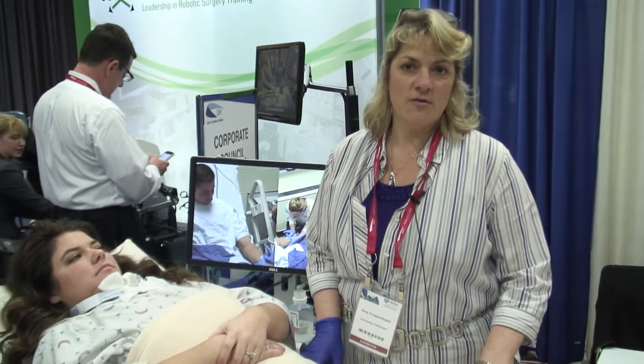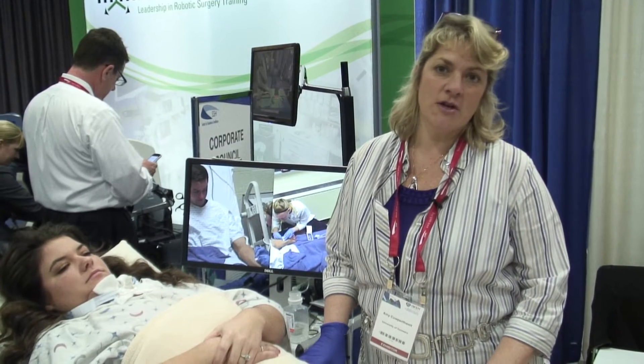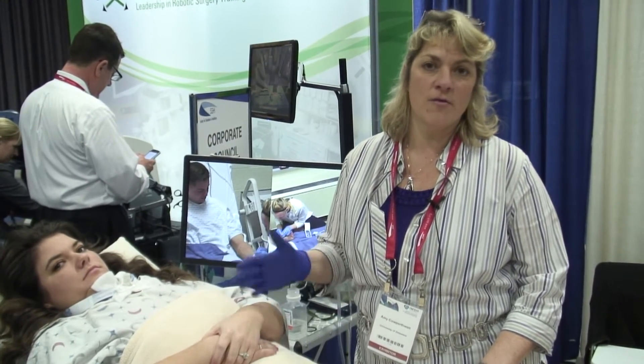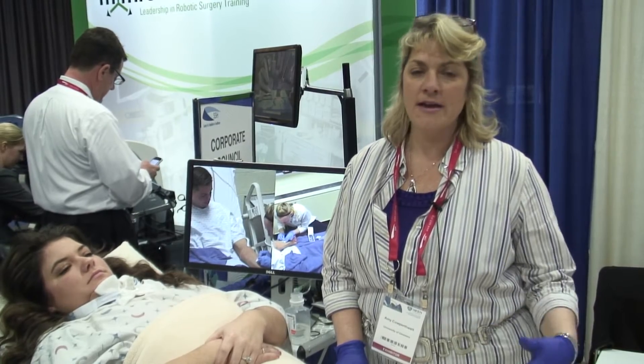SimuCare is a spin-out company from the University of Delaware. We started in 2013 working with theater engineering and nursing students to create wearable overlays that can go on top of standardized patients and really recreate the authentic experience that they're going to see at the bedside.